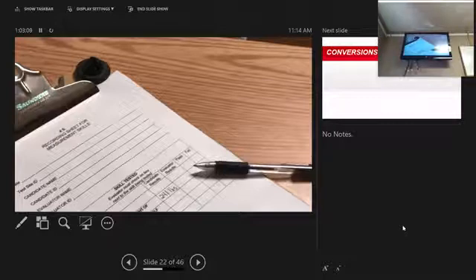And reach. Thank you. I'm going to wash my hands and record. For this scale, we're going to make sure that we put the unit of measurement.